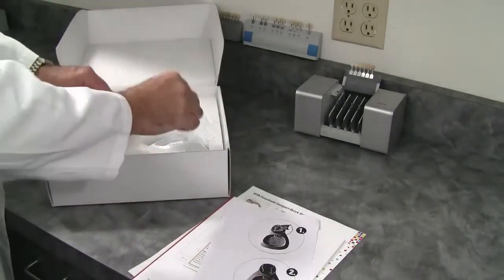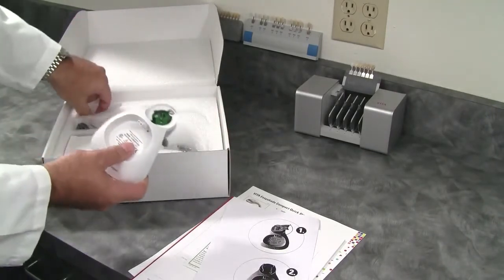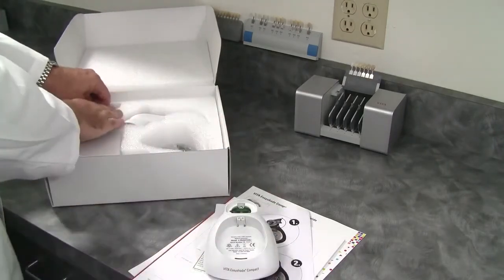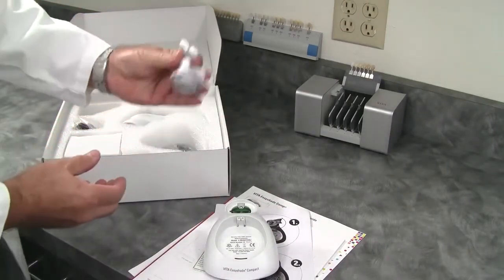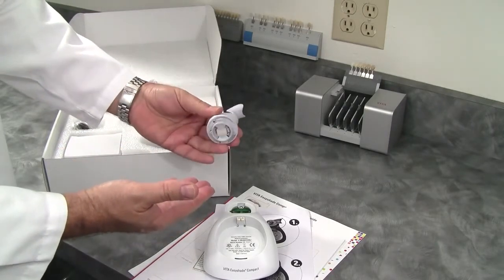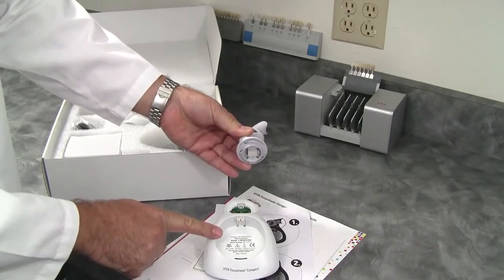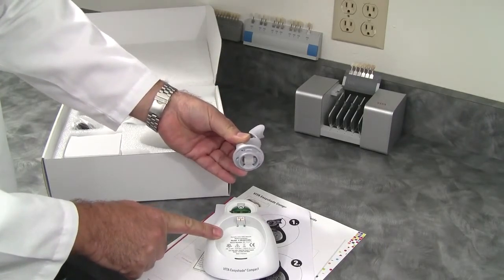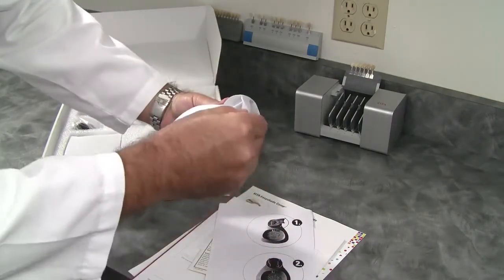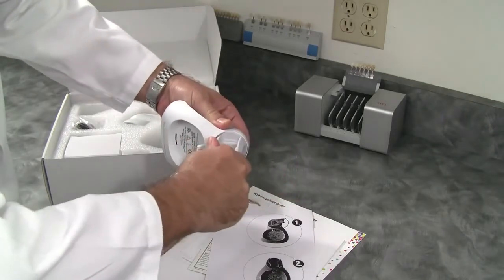Take the base plate out of the unit. Take the calibration holder out of the unit. This is very good — it comes supplied separately because if you are actually using this product, you can take this off of the base unit and autoclave it for cleaning purposes if you wish. To put the unit together, you simply align the two components and twist.